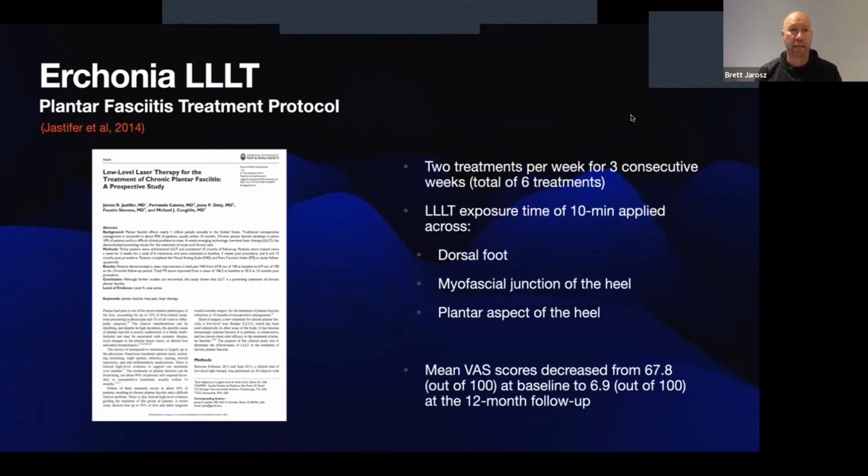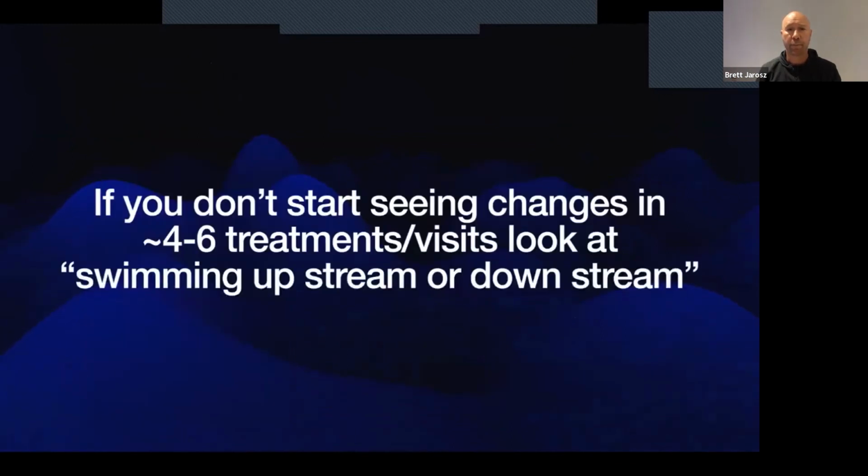That's all they did. And again, we can see from that research that got FDA clearance, decreased from 67.8 out of 100 at baseline to 6.9 at the 12-month follow-up. So again, there were positive effects, and they continued to get better after the laser treatment was over. Now, this is a clinical part for us.